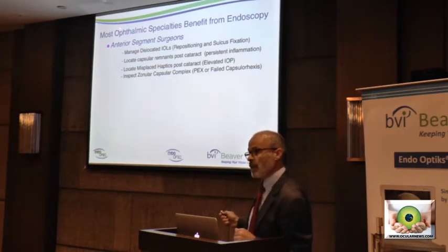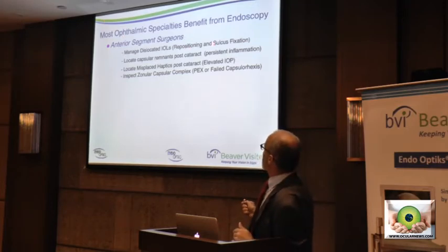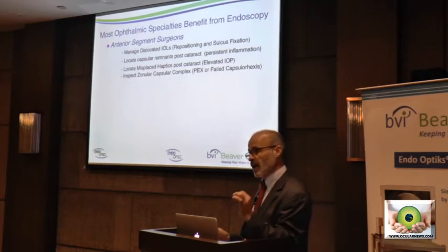I'll show you a film a little later on from Boris Malyugin from the Fyodorov Clinic on sulcus fixation of haptics under endoscopic view. Fast, precise, elegant, safe.